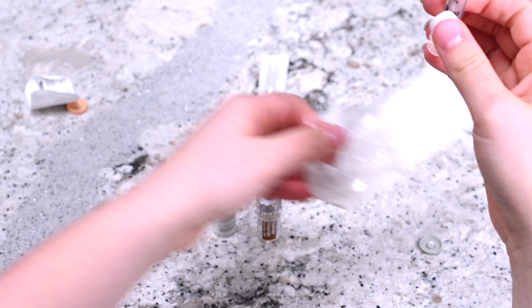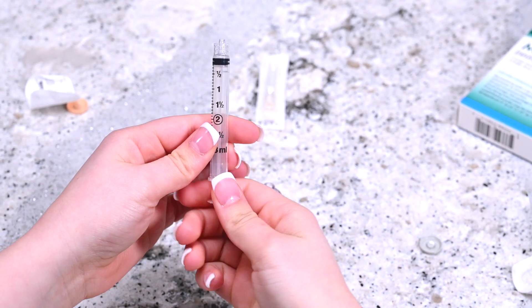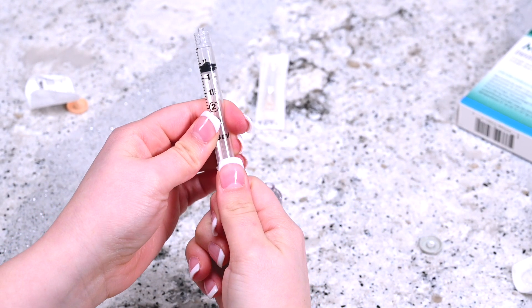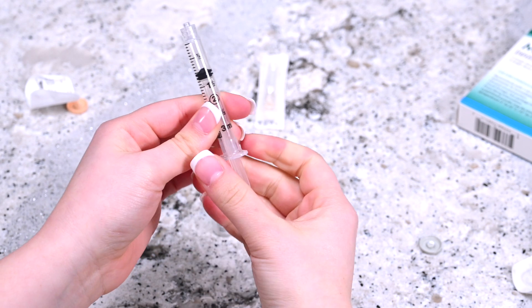Open the syringe package. Draw air into the syringe by pulling the plunger to one ml. Twist syringe onto the q-cap.